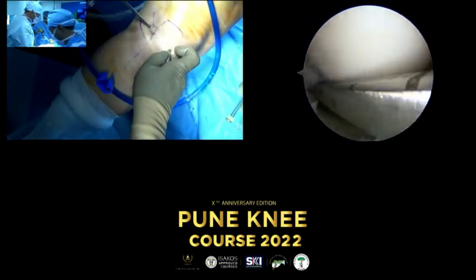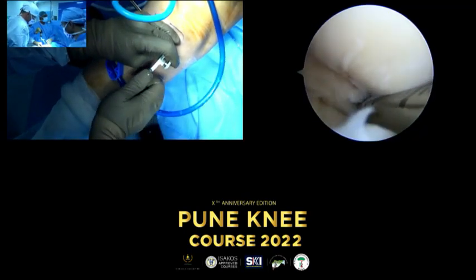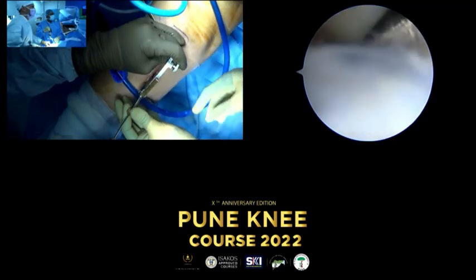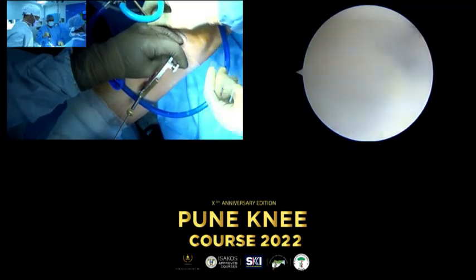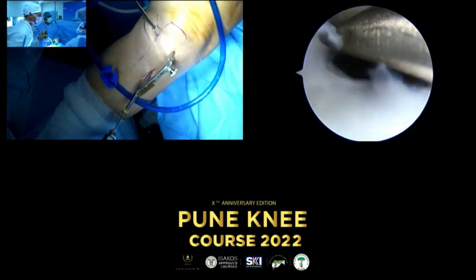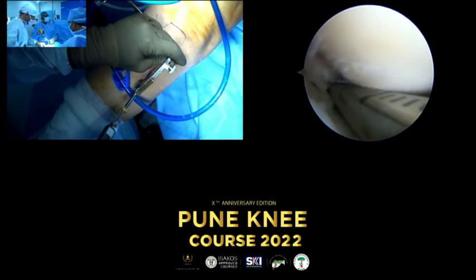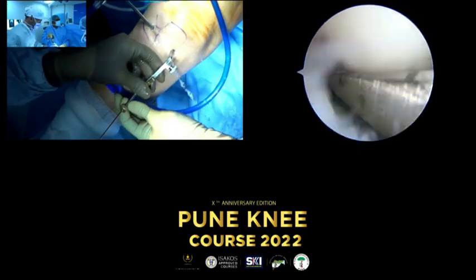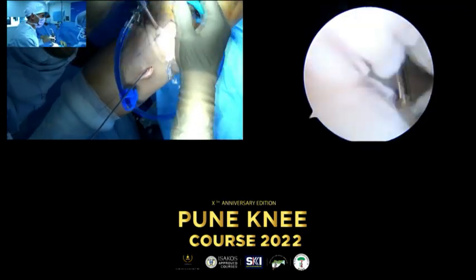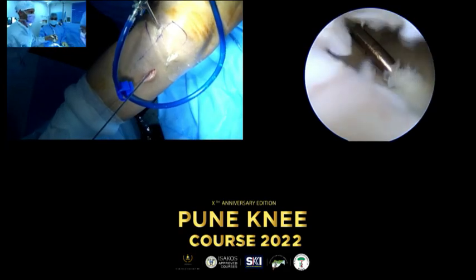Okay, I like it there. That's fine. Okay, fourth try. It was wrong. Can you show me there? Upper there. I can't see anything. I don't know why. I will switch. No, I don't like it. You see, it's too anterior, the thing I said before. I will do it hand-free. Can you see this?